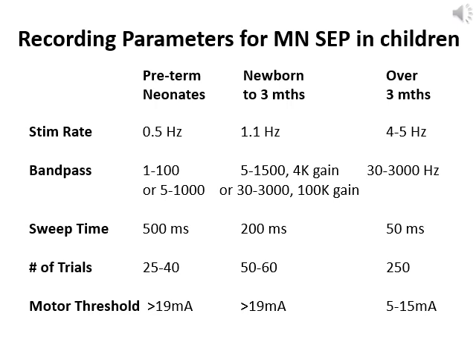The other thing that's interesting is that the motor threshold is much higher in the preterms and newborns because the nerve system is not as well myelinated. For this reason, it doesn't conduct as well, and so a higher stimulation threshold is required to get a motor threshold in the babies. At 3 months of age, we're using stimulation thresholds that approach what is used in adults.